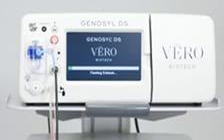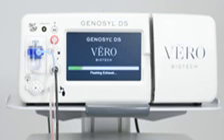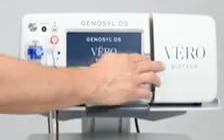The consoles will eject the cassettes during the system shutdown. Wait until the console shuts down and the display screen appears blank prior to proceeding. Repeat steps for the other console. Open the cassette access door and remove the cassettes by pulling them straight out.